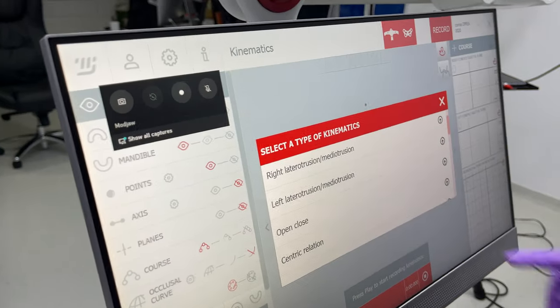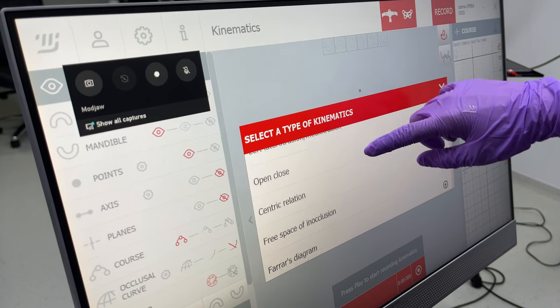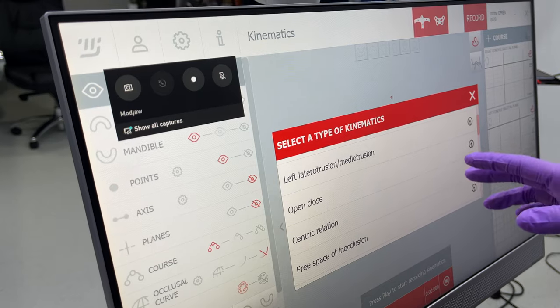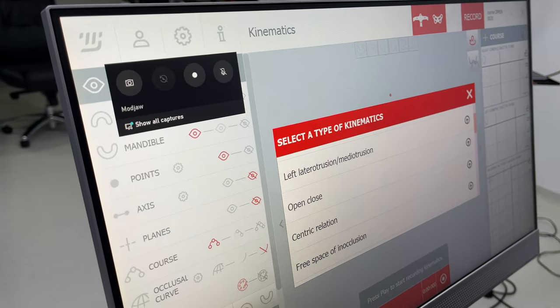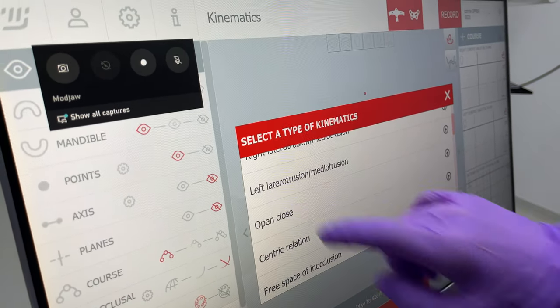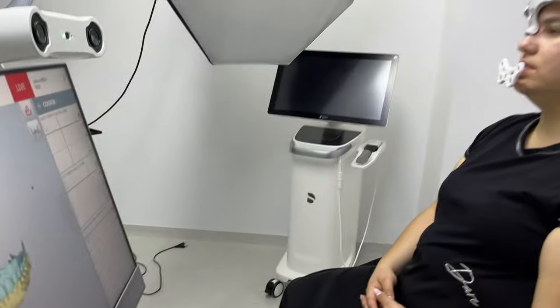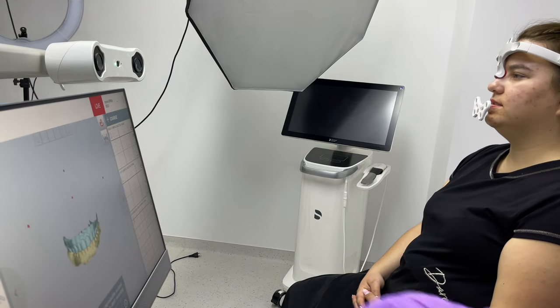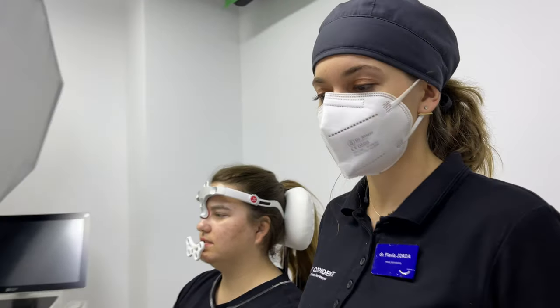Okay, so here we have the basic moves of the jaws, because when we bite, when we normally chew something, for example, we don't just usually open and close. We have a dynamics when we do that. So we'll start with the most simple one. You can see now in real time, open, close, her movements. Yes, this is extraordinary, and it's actually the first time we can see in a digital way this stuff.